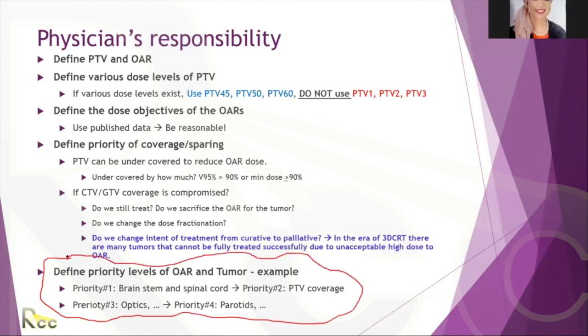So you should always delineate your organs at risk. In this case, you are worried about the optic chiasm, so maybe you need to do some fusion with an MRI data set so you can better delineate the optic chiasm. That's the first thing. The second thing, you can use a little bit of field-in-field technique. We're covering it in the next lecture. So you can reduce the dose to the optic chiasm without really underdosing the tumor. It's another technique you can do, field-in-field.